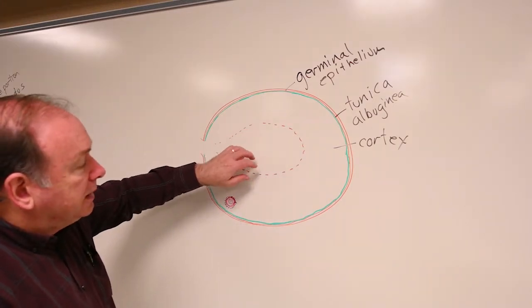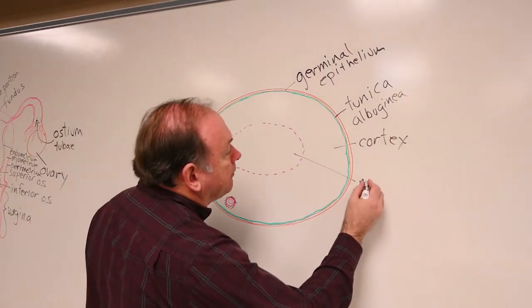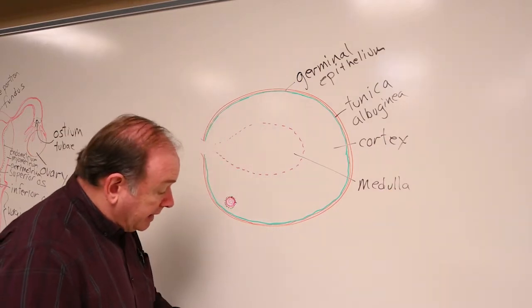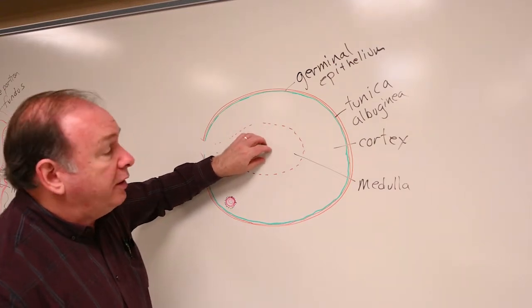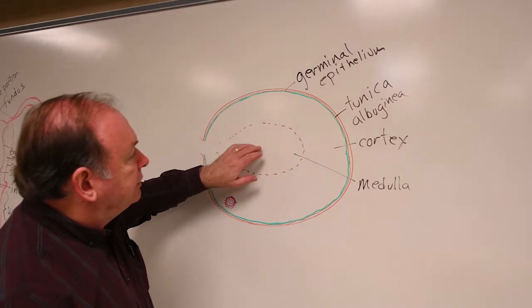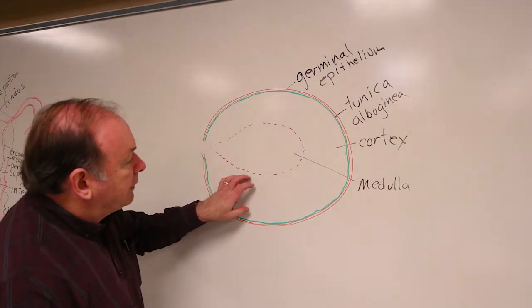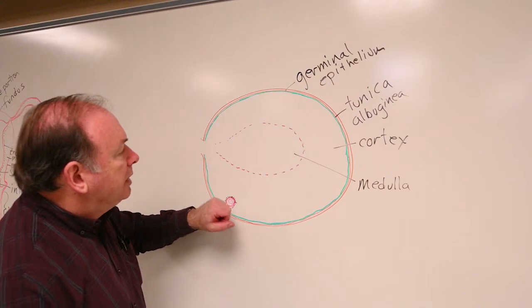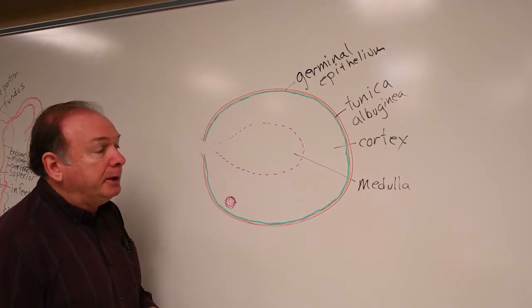Now the medulla in the center. The medulla has a loose connective tissue with blood vessels and nerves. More typical connective tissue with lots of blood vessels and nerves populating that central region there. So it does not look like the cortex region. It doesn't have that highly cellular connective tissue and smooth muscle component. Mostly vascular tissue and loose connective tissue and nerve in there.